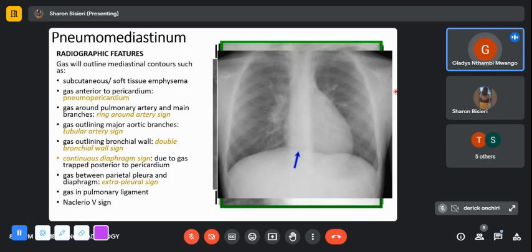But the requests for barium swallows or contrast studies are really not that many. You would definitely do a CT, which will give you a little bit more information. If you still think there could be a problem with the esophagus, you can even give them a non-ionic contrast media to swallow in case they aspirate, and you can still quite clearly outline any leaks. Any fistula, you'll be able to pick up quite well.